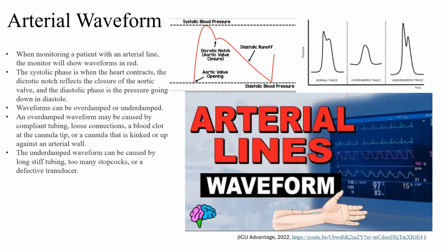If you're seeing alterations in that waveform, we call that overdamping or underdamping. An overdamped waveform may be caused by issues with the tubing, loose connections, a blood clot, or maybe the cannula is kinked. So that can happen.